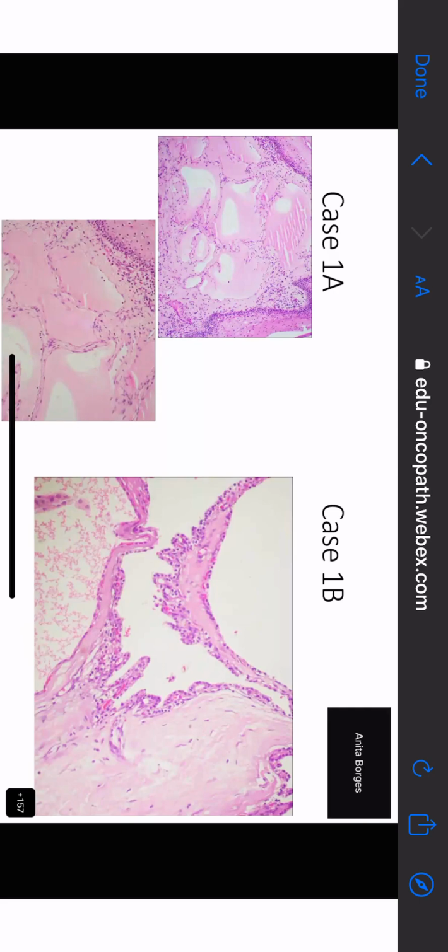Acha. Now that is interesting to me. Which epithelium is discontinuous, Suveta? When there is ulceration. But do you think that this is ulcerated epithelium or something? No, ma'am. Lining those cysts? No, ma'am. So there is some confusion going on, okay? When we see dilated spaces, which are essentially sitting in a stroma, do you realize that, Suveta, that these dilated spaces are sitting in a stroma, right?